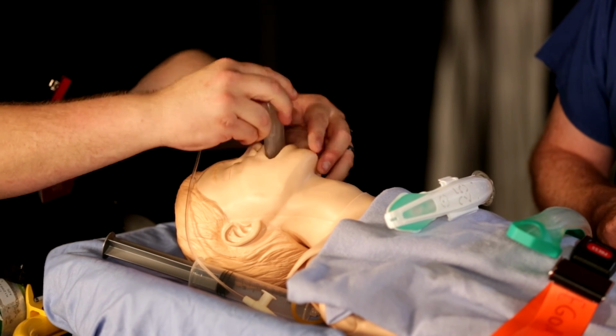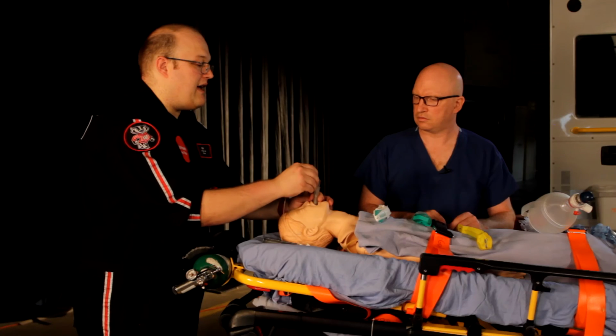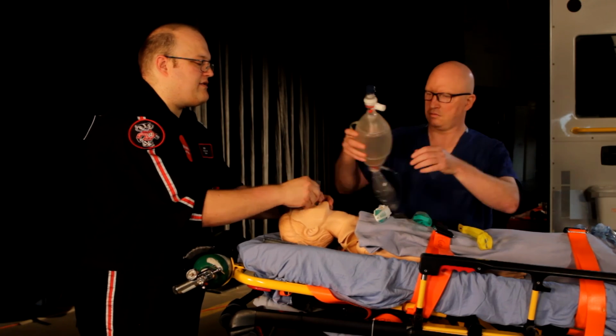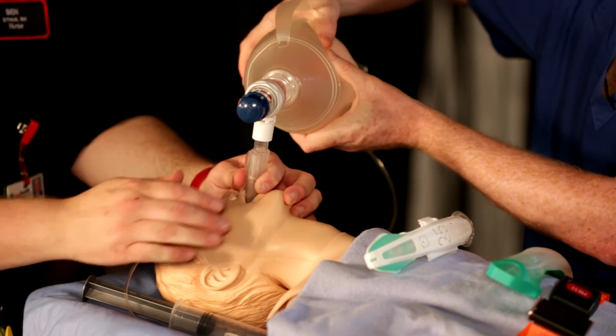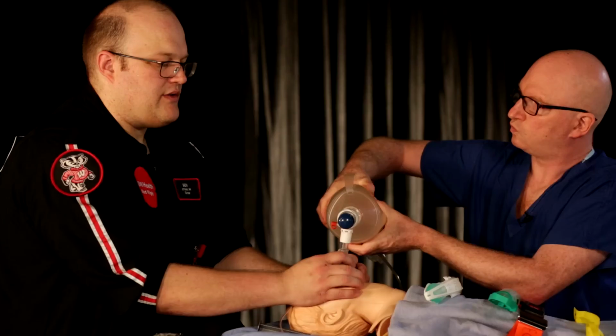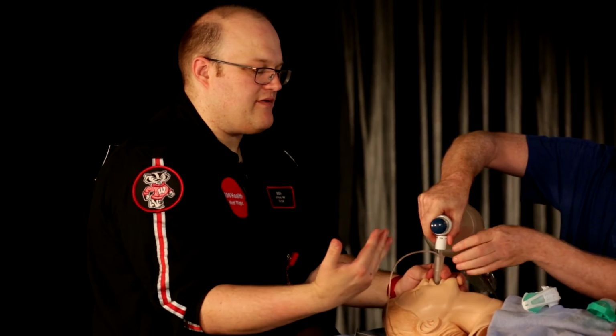But I can feel it seating, and then I'm going to hold the tube, ask Dr. Kohler to put the bag on and see if we can inflate. And then pass the tube a little bit further through the OG port, and I conduct a suction. Okay. So again, we just want chest rise. It doesn't have to be huge excursion, just enough to move it.